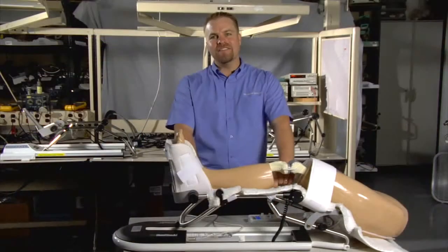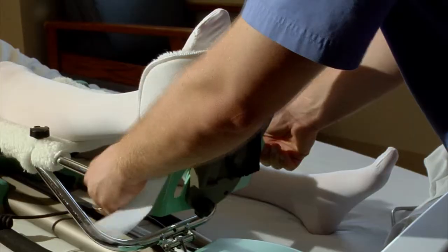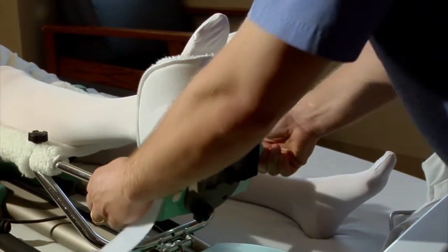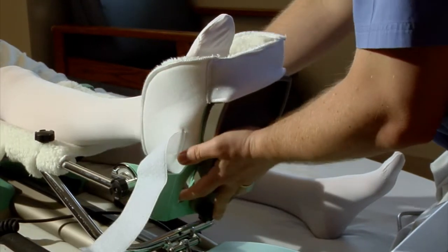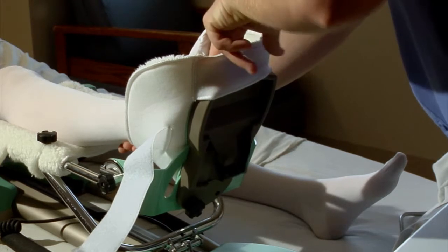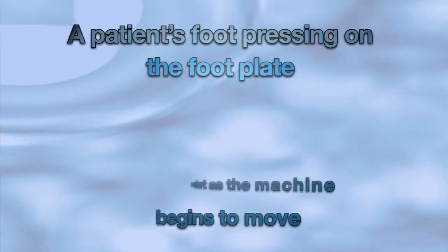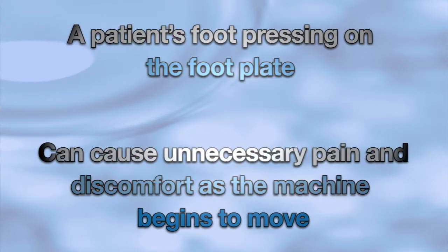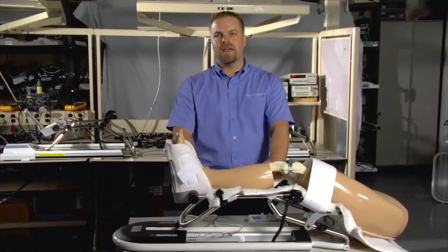Now that you have the femur adjusted and the knee aligned properly, it's time to adjust the tibia length. This can be done by loosening the knobs located at the distal end of the CPM machine, close to the patient's ankle. Slide the foot plate toward the patient's foot. Then stop when you can slide the palm of your hand between the sole of the foot and the foot plate. It's important to note that if the patient's foot is pressing on the foot plate, this can cause the patient unnecessary pain or discomfort as the machine begins to move. The extra space created by the hand's width makes all the difference in the world.